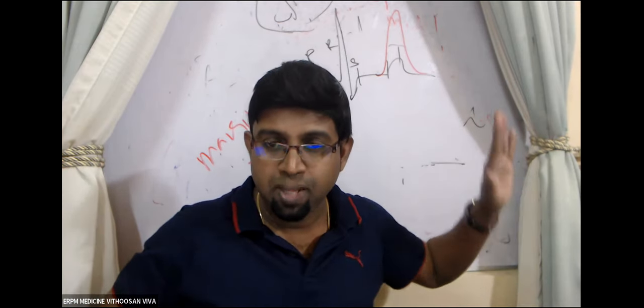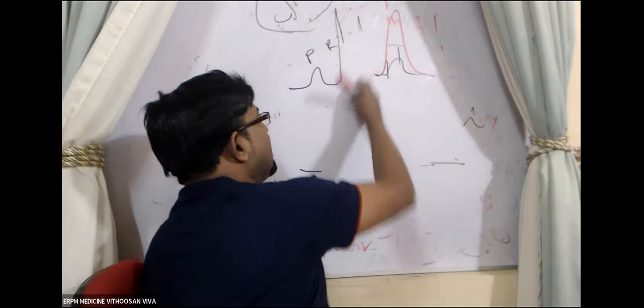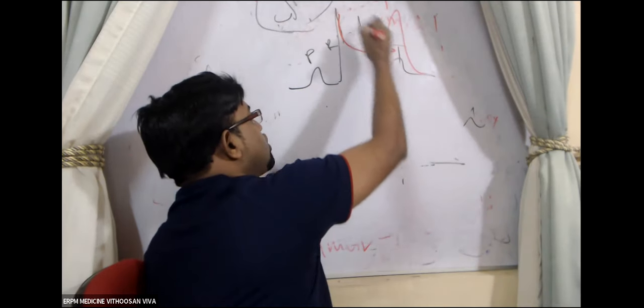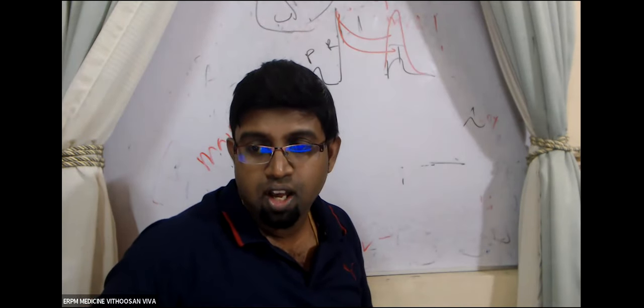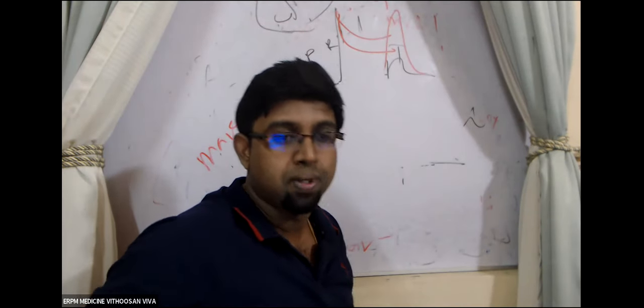Hyperacute T waves. Then after some time, this ST segment will start to go up. That's what you call what? ST elevation. Come on, guys, answer. ST elevation MI.